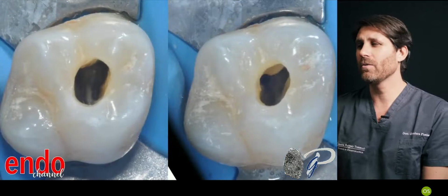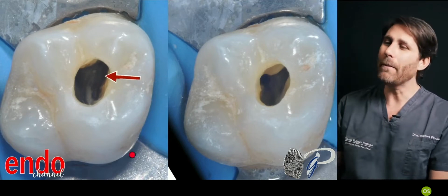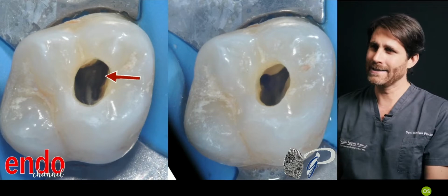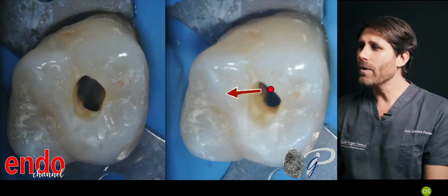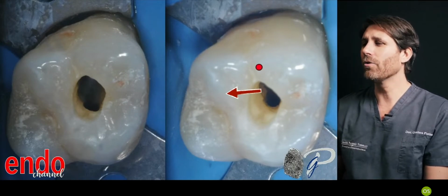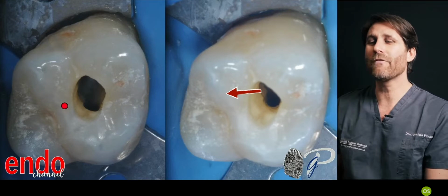We need the possibility to search and look for the MB2 root canal in depth under the microscope to see if there is an accessory canal and accessory anatomy. If we maintain the pulp horns like this, we need to clean what is under the pulp horns, the necrotic tissues and pulp tissues. We have to clean them.